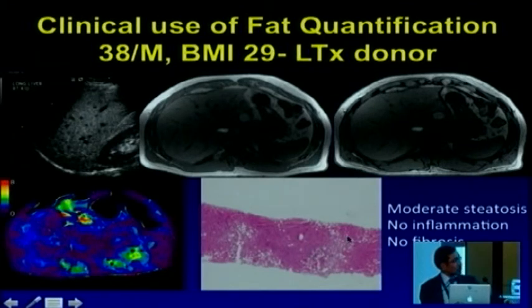And this patient actually did become a donor because he did show a decrease in BMI as well as further decrease in weight, and then on follow-up his ultrasound also improved. I was just trying to highlight this is where we would like to use MRI index to quantify, to in fact show before and after intervention that there is reduction in fat.